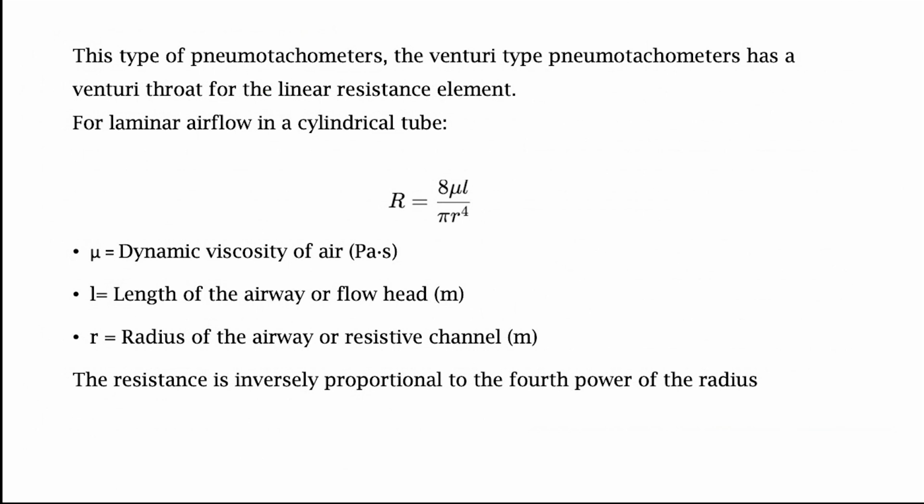It's actually a blessing, right? And it is also a curse. It's both. So a small change matters. If I'm trying to make measuring tubes that vary in radius just by a little bit, it will hugely change my resistance. So the tolerances are extraordinarily hard to achieve.